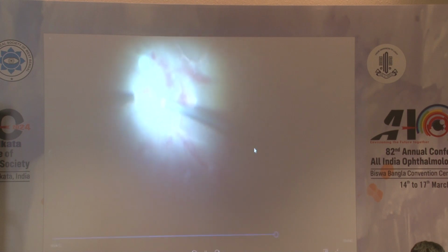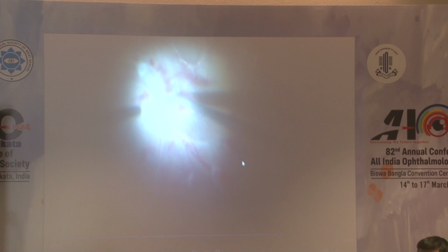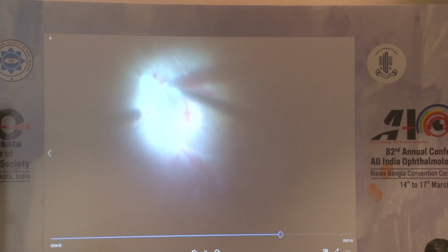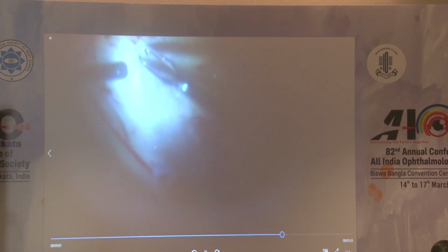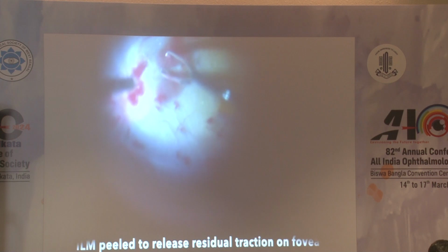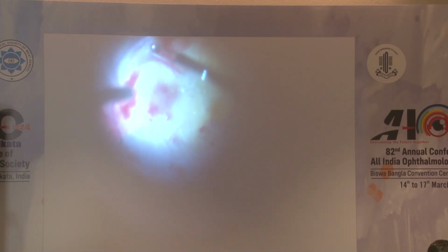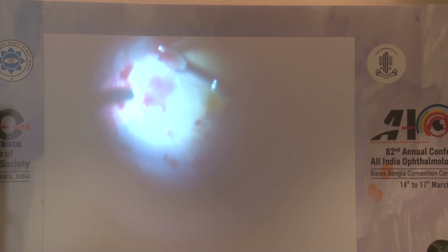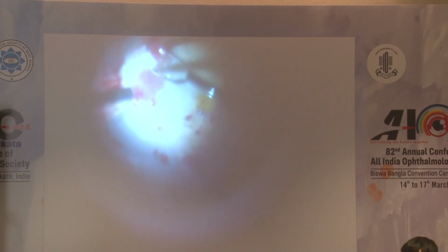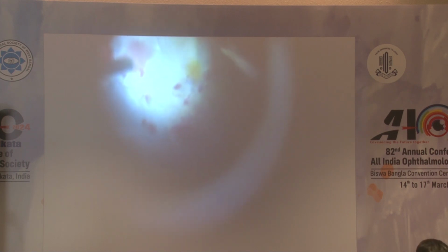You can also notice that there was a bleeder cauterized in this area. The whole of the vitreous was now removed. ILM peeling was essential in this case because there was an area where there was traction and that area was causing ILM folds. Since ILM folds were seen and since the retina was a little pulled in the direction of the traction, ILM peeling would release a little amount of traction on the fovea, which may cause metamorphopsia in the post-operative period.